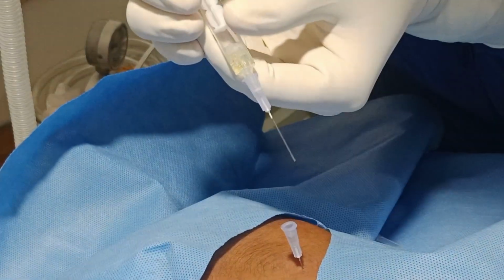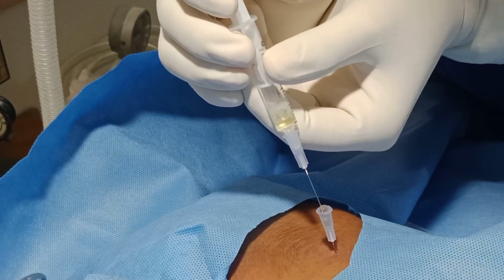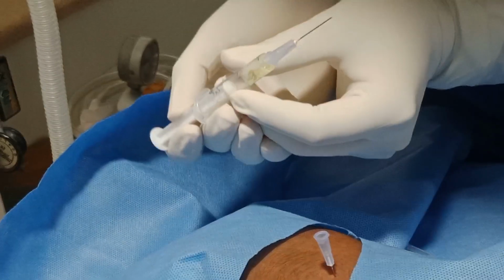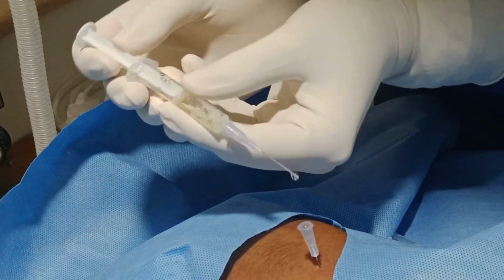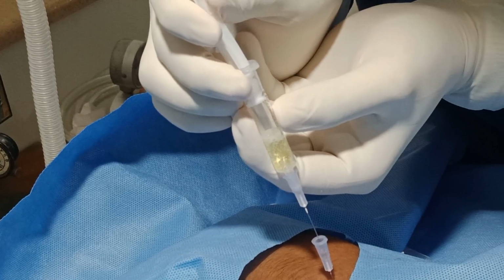Otherwise, routinely when we do it, we put the baby in left lateral or right lateral position, and sometimes there are chances of the needle moving this side, that side, but you see how static it is, very static. So I think you got it in one shot, and there's no trauma. You can see there is a clear fluid, and you could get the fluid in one shot.